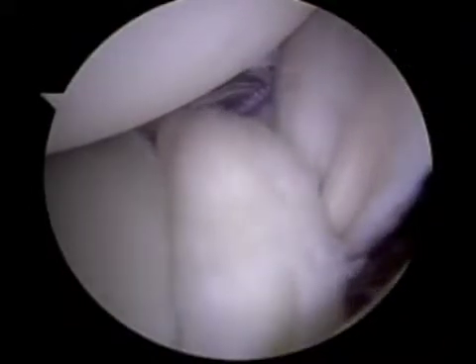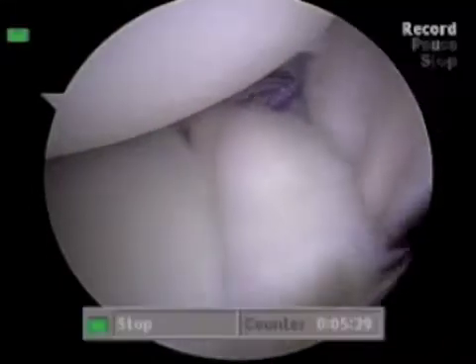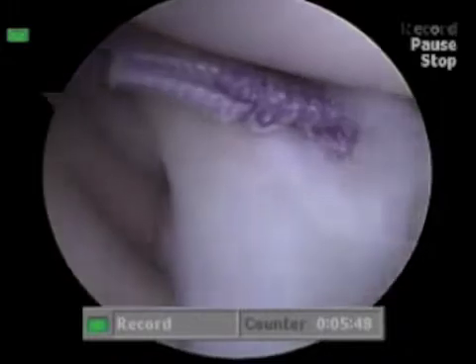At this time, additional sutures are placed both anteriorly and posteriorly to balance the capsule. Absorbable sutures can be utilized at this juncture with an effort to decrease the drive-through sign by at least 50 to 75%.